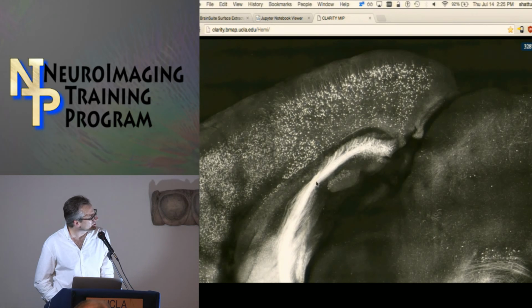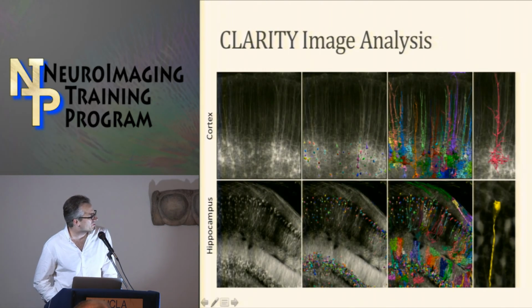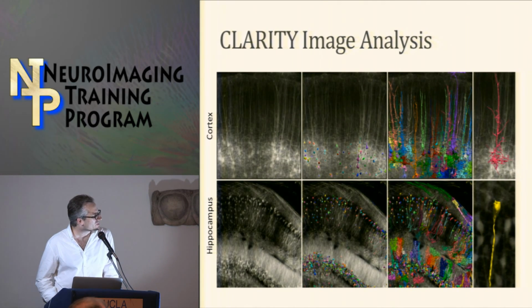And we are working as well on automated segmentation, finding models of individual neurons, which is quite challenging because the signals here aren't nearly as clean as MRI, which makes it really difficult to find some of the objects, particularly when they're crossing in various ways. But it's an exciting problem and one that we're really interested in.